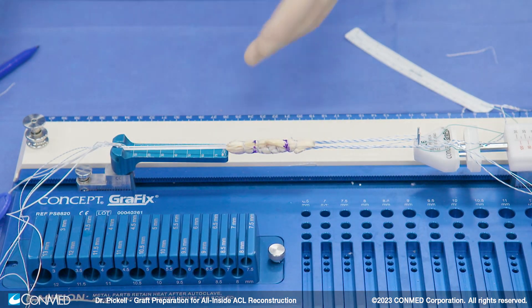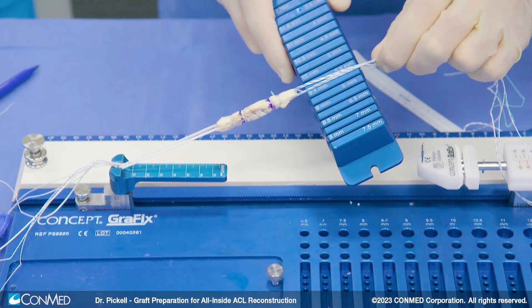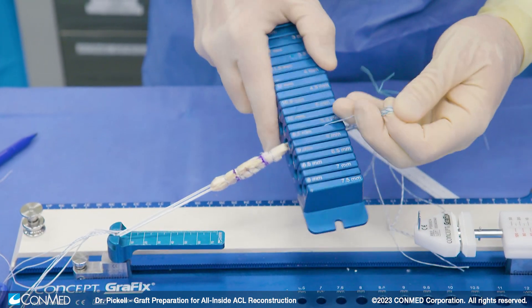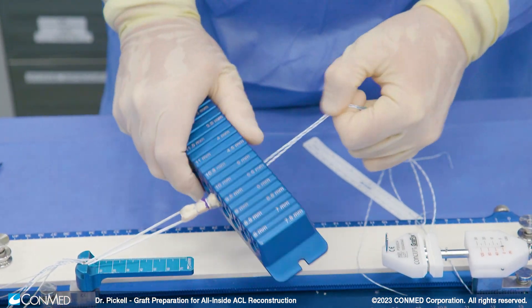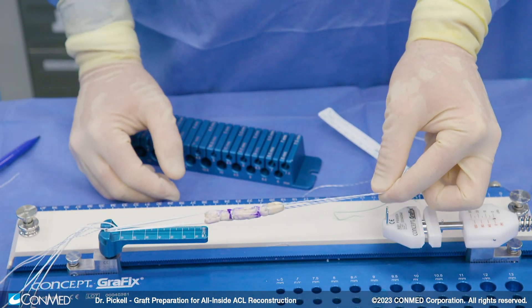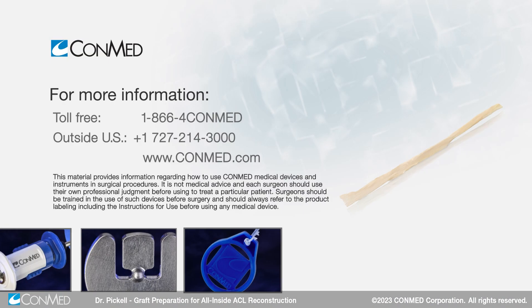So there it is marked — there's our final graft. We just take our sizer to decide on our tunnel size; we think this one's probably going to be about a 9.5, and it's actually more like a 10. So we've got a nice big graft from a single tendon harvest that's more consistently around a 9.5 or 10 because we're taking that larger tendon. There's our final graft product. Thank you very much.